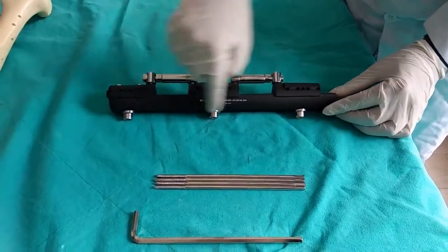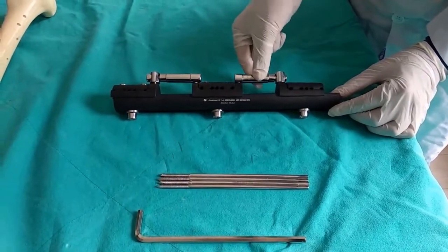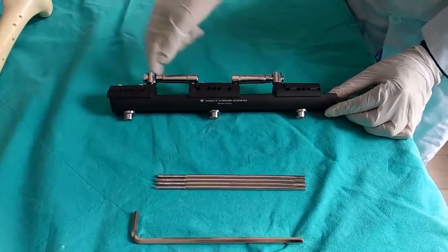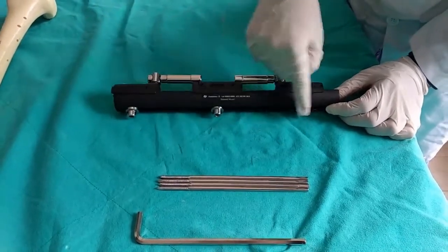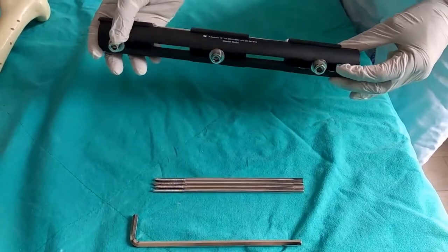The fixator consists of a rail, three clamps, and two distraction-compression parts. We also have Allen key screws for the shanz screws and for compression and distraction.